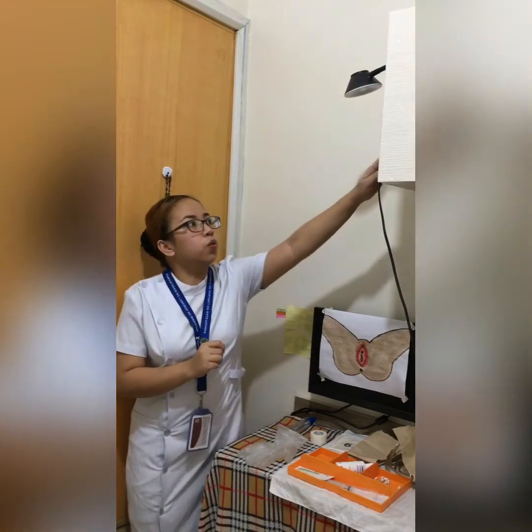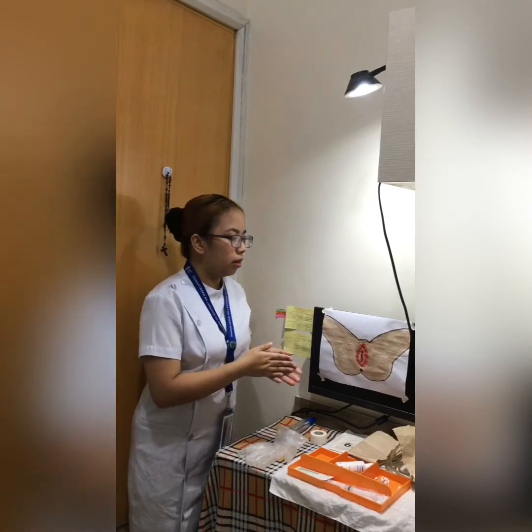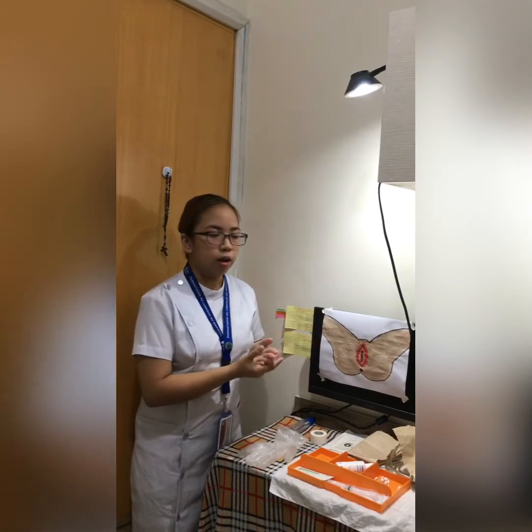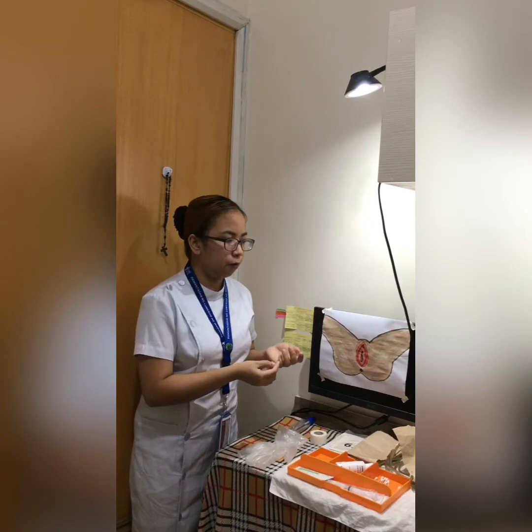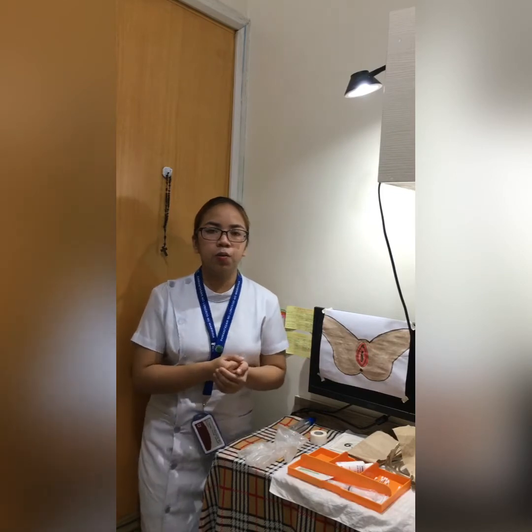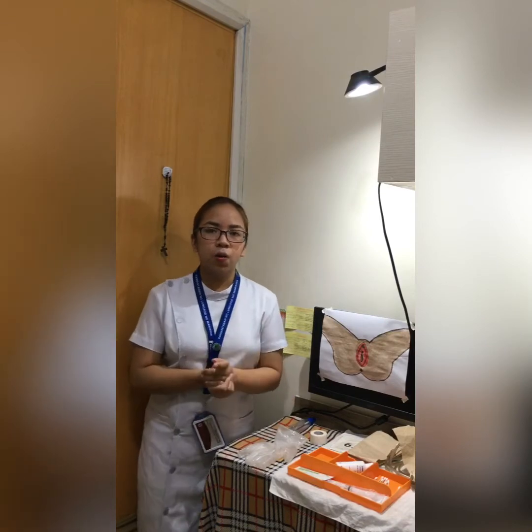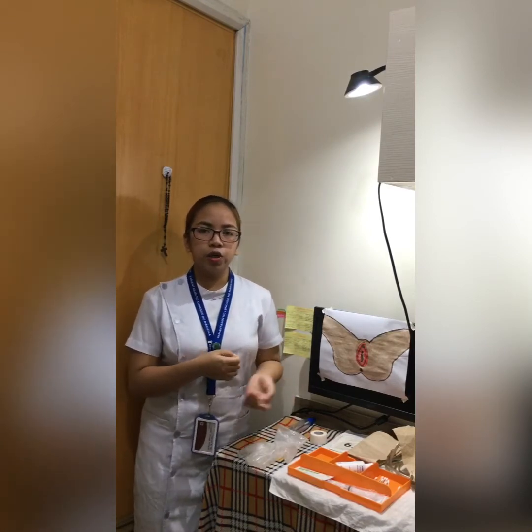So I'm going to open the lights to obtain a better view of the external meatus of the patient. If you're right-handed, you must stand on the right side, and since I'm left-handed, I'm going to stand on the left side. Last is to apply sterile technique during the whole procedure.